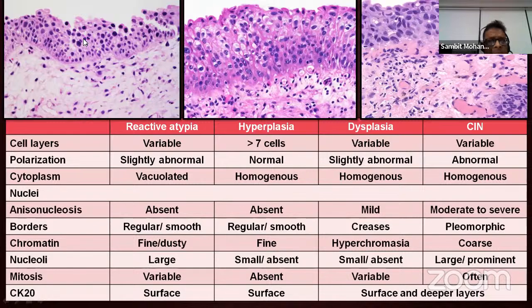But believe me, CIS is a histologic diagnosis. It doesn't need an immunostain. Unless you think about CIS in histology, you would not diagnose it. And these lesions are usually seen when the layering is low. It is 2-3 layers and is denuded out. So how is immunostain going to help you in differentiating a CIS from reactive atypia?